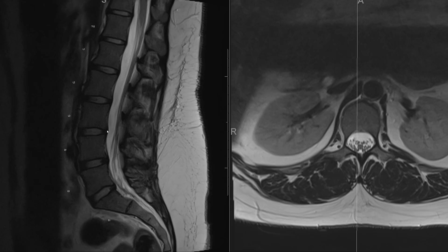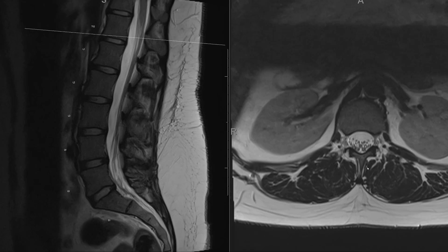Then we have the ligamentum flavum posteriorly. It's easier to see on the axial in its full extent, but here in the midline this dark line is the ligamentum flavum. It has kind of an undulating course on the sagittal images, so let's take a look on the axial.